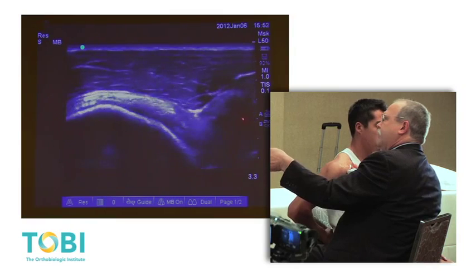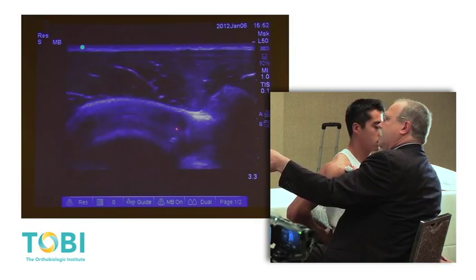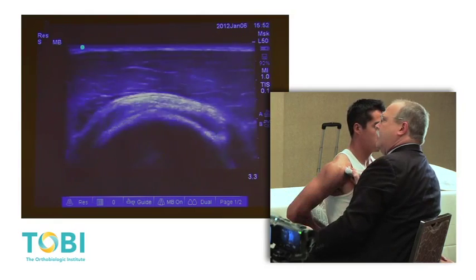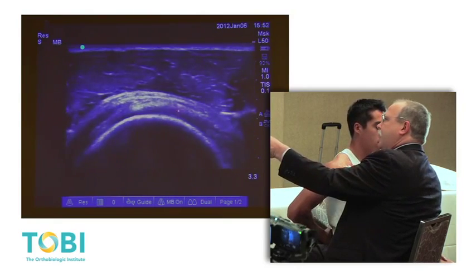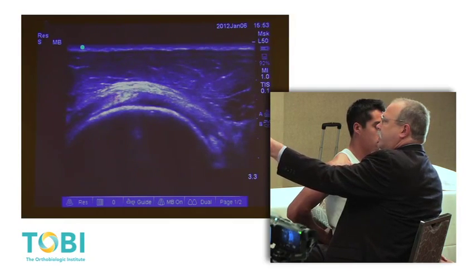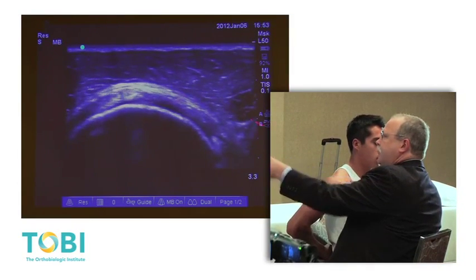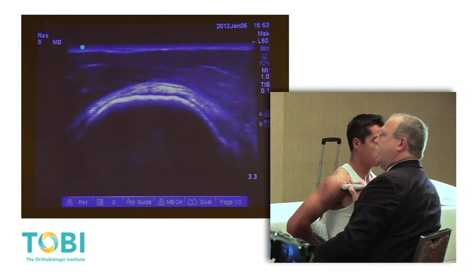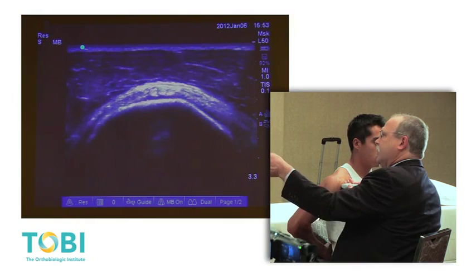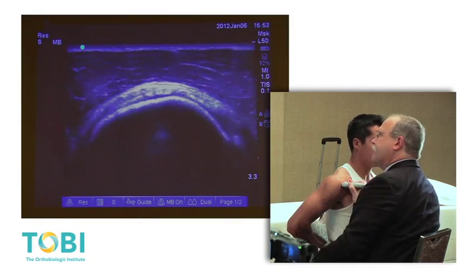Here's coracoid, right there. Biceps tendon. Anterior supraspinatus. I'm over the humeral head, so I'm over the proximal portion of the supraspinatus. Here's that oblique line separating, overriding infraspinatus and underriding supraspinatus. If I come down distally, now you're seeing those two flattened zones along the tuberosity. Here's infraspinatus fibers attaching, supraspinatus fibers at their enthesis.